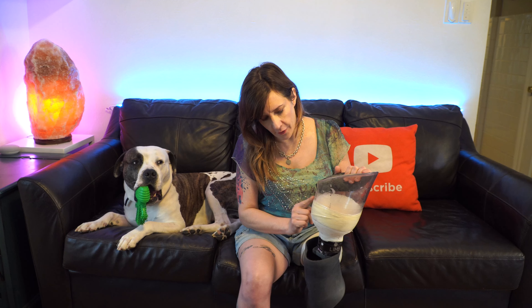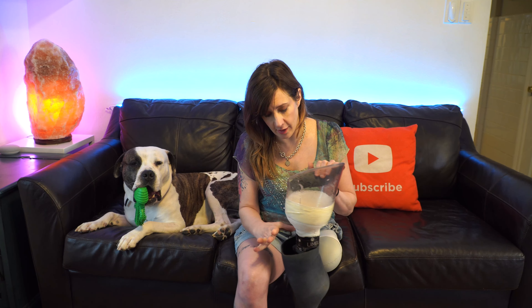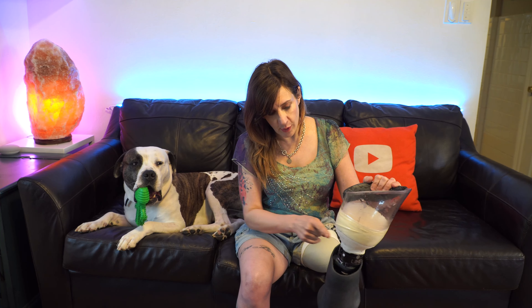The reason I'm wearing this belt on my check socket is to keep my leg on my body, because the check socket is actually a little bit too big for me already. My prosthetist is making another check socket that is a little bit smaller, but in the meantime I can wear my prosthesis — I just have to use a belt because my leg will fall off if it gets a little bit sweaty. It just makes me feel a little bit more secure.